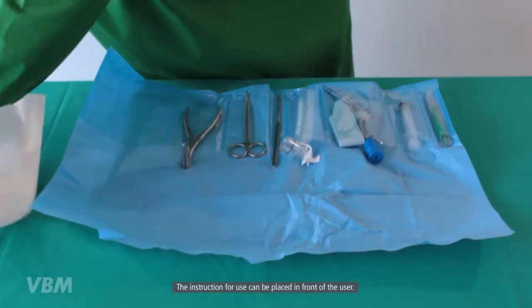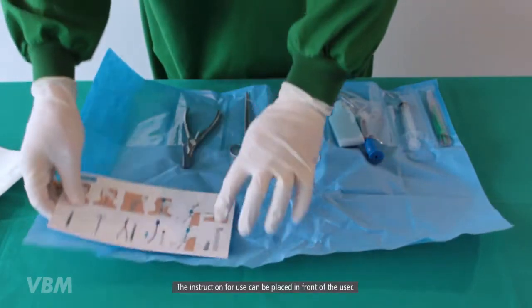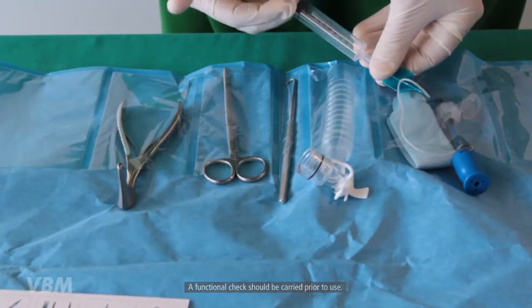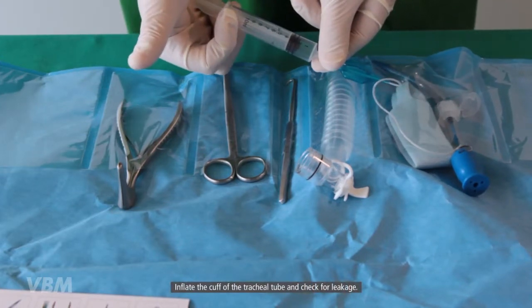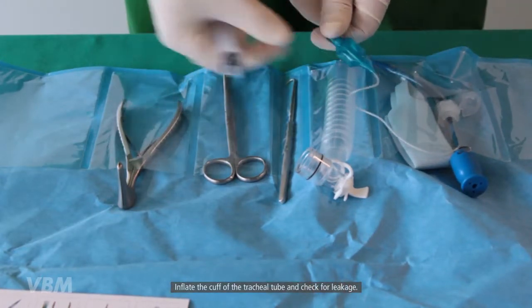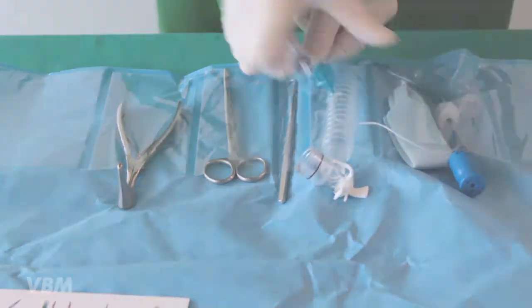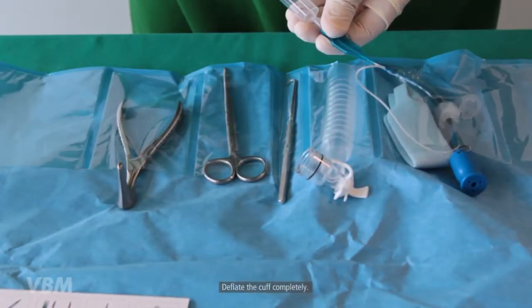The instruction for use can be placed in front of the user. A functional check should be carried out prior to use. Inflate the cuff of the tracheal tube and check for leakage. Deflate the cuff completely.